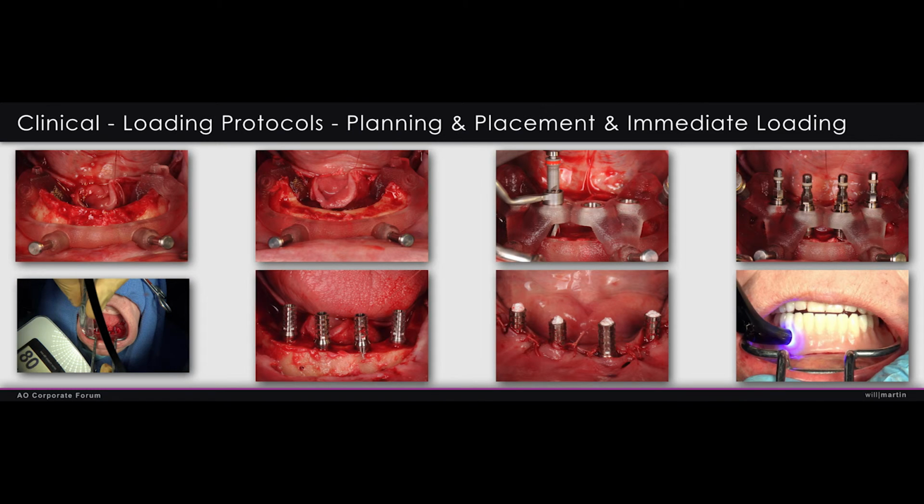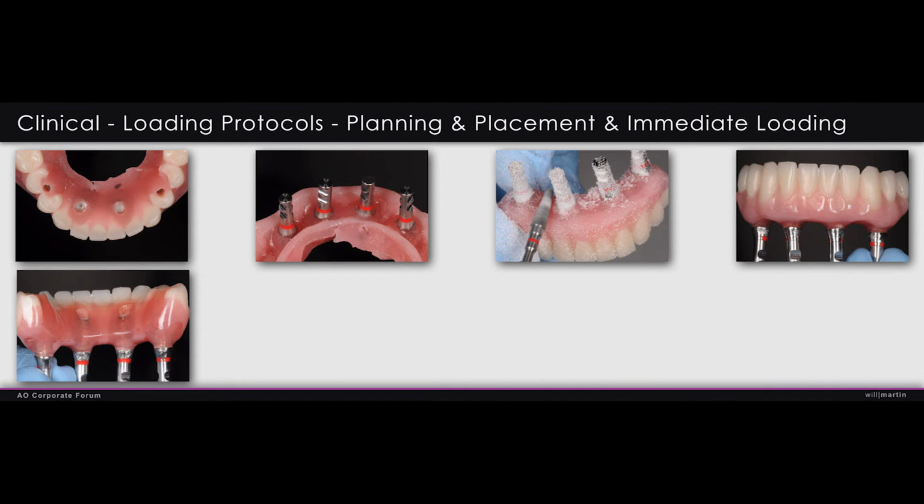So here we have the temporary copings in place, everything's sutured, the denture gets jumped, and then back in the laboratory we go through the process of removing the flanges and rounding things off so the patient can maintain it. And we've been doing this for over 15 years, but it's kind of become mainstream in our practices now.